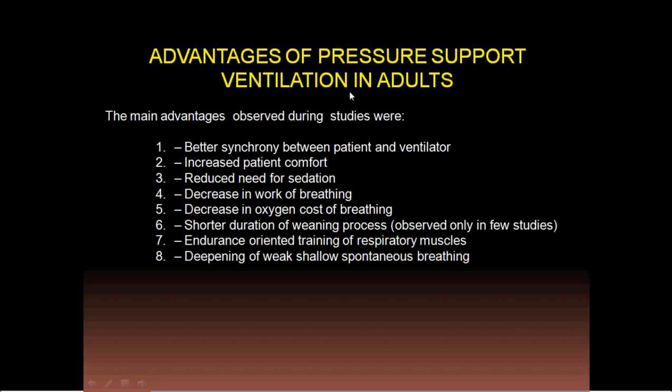deceleration of the wave. So, to conclude, these are the advantages of pressure support ventilation. It is a spontaneous mode. It gives better synchronization regarding flow and volume, but you have to adjust for the inspiratory time. It increases patient comfort, reduces the need for sedation, and decreases the work of breathing, which is shared between the ventilator and the patient. It decreases the oxygen cost of breathing and shortens the duration of weaning. So this is the last.